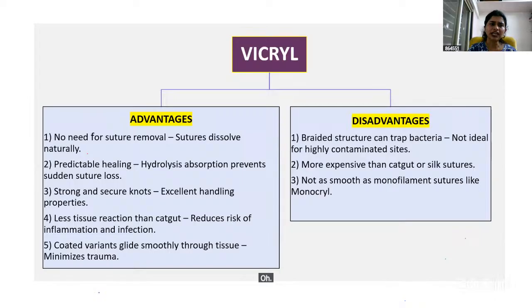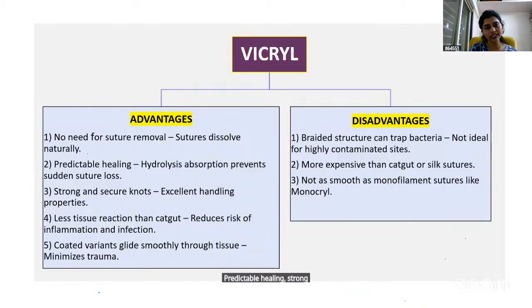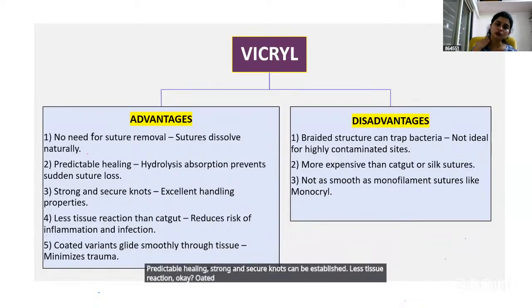Now the advantages are the same. There is no need for suture removal because the suture is going to resolve on its own. The general advantages of an absorbable suture: predictable healing, strong and secure knots can be established, less tissue reaction. Okay, coated variants, they glide smoothly.